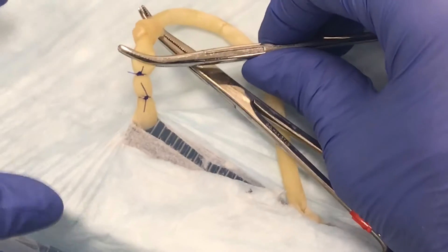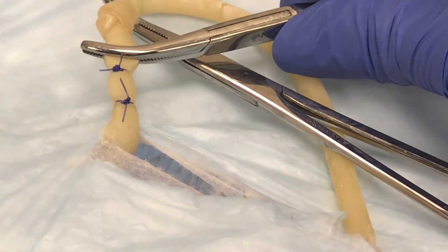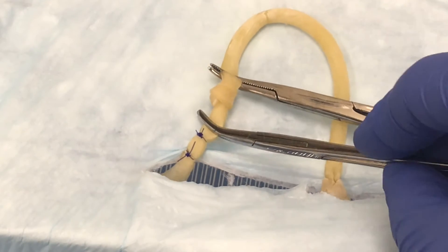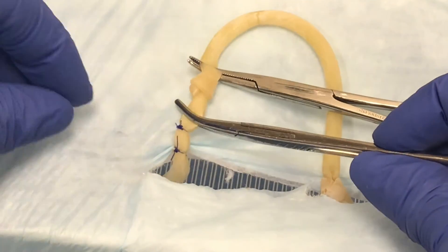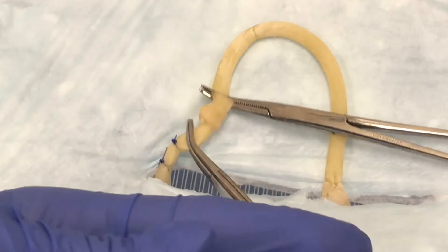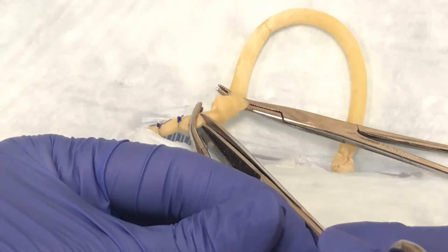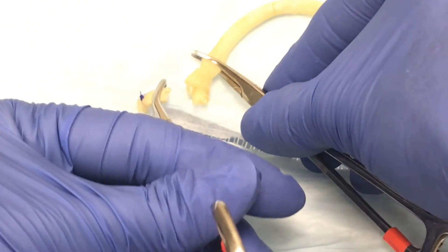These ligatures are nice and tight, my knots are secure, and I don't see any looseness. I see a nice waist where both ligatures are, I haven't incorporated anything I didn't intend to, and I'm still far away from the ovary. At this point I'm ready to transect my ovarian pedicle — always making that transection between two clamps. We'll cut right here, pulling the ovary back toward the uterine body, leaving myself enough room to grasp the ovarian pedicle but still far enough away from the ovary that I don't incise into it.